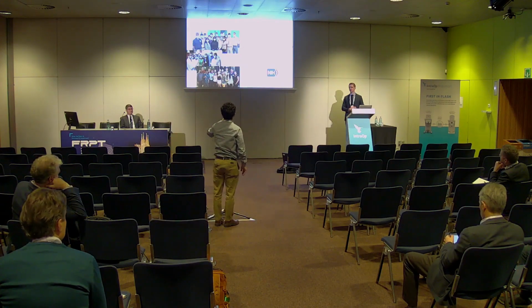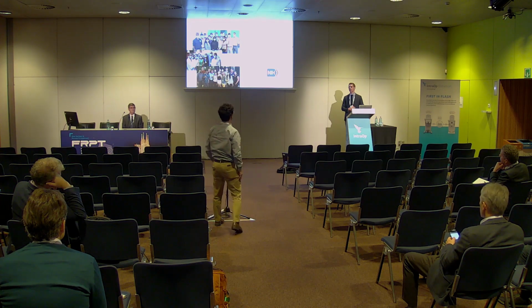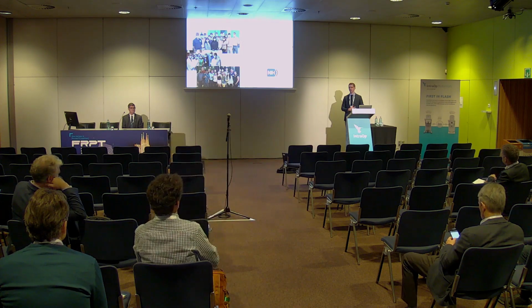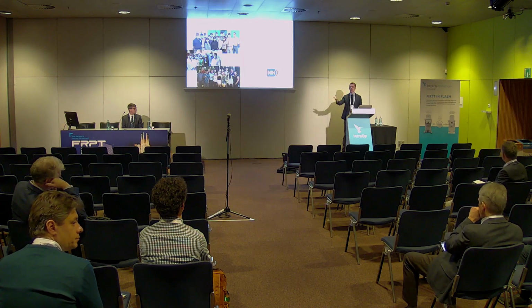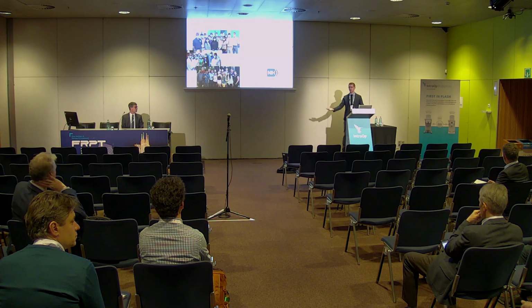Great talk. Are you considering any treatment planning implementation, 3D planning, or is this all going to be based on basic PDDs and lookup tables? We have developed our own in-house treatment planning system. It's rudimentary. It doesn't need to be very advanced in this setting. But we model our beam in RayStation so we can have a treatment plan, and that's what we're going to have in the patient setting. We're going to look at how we can deliver it and look at the dose rate distribution as well.